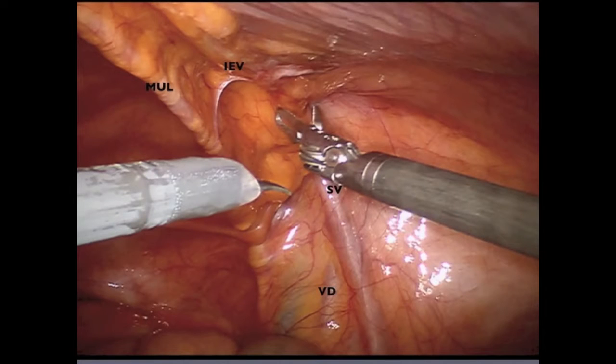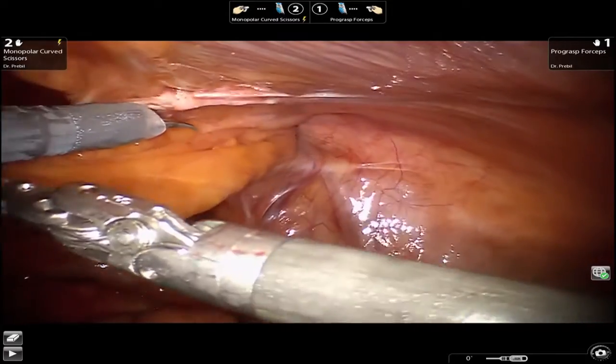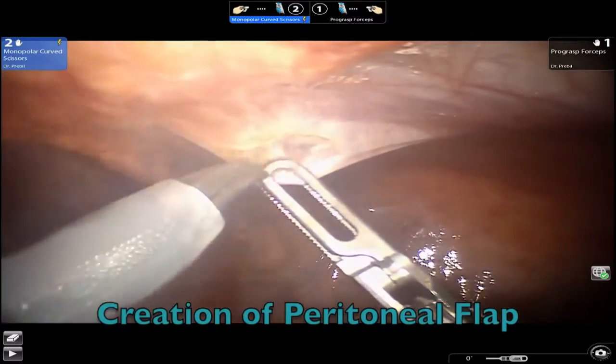Internal surface anatomy reveals the medial umbilical ligament, the inferior epigastric vessels, the spermatic vessels, as well as the vas deferens. This view also reveals a pantaloon-type hernia with direct and indirect components.